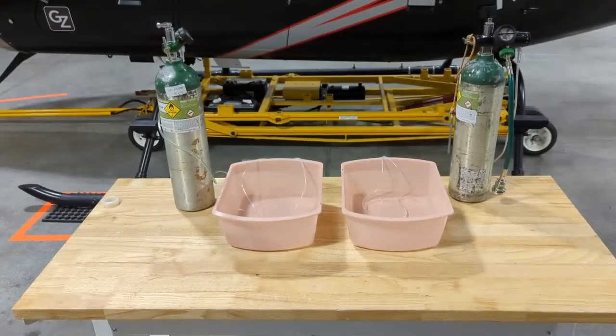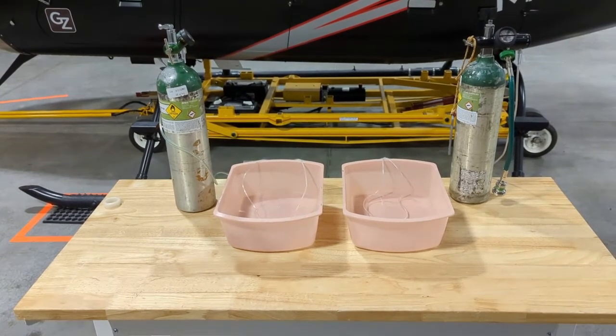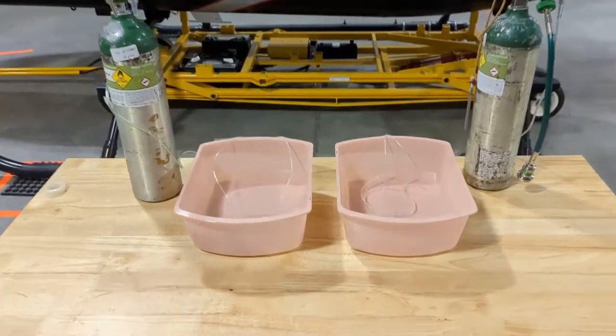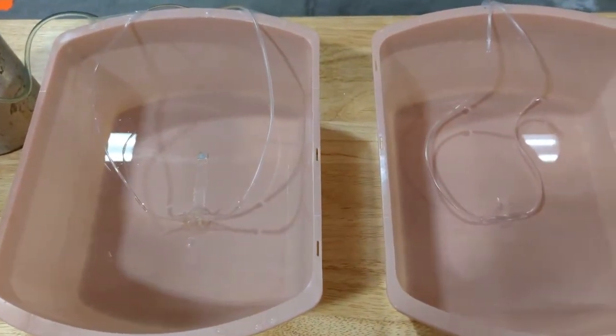This will demonstrate the flow rate difference between the normal nasal cannula and the end-tidal nasal cannula. We have two D cylinders with the same regulators. On the left is the end-tidal cannula, on the right is the normal cannula.